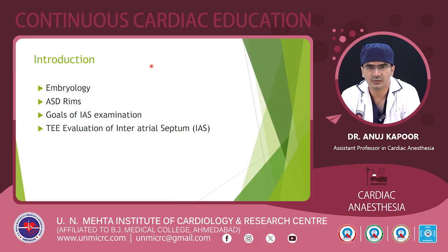Then we will look at the rims of the ASD that we will have to evaluate, especially in a case of device closure. Then the goals of examination for TEE and the complete evaluation of the interatrial septal defect, what we will have to do.